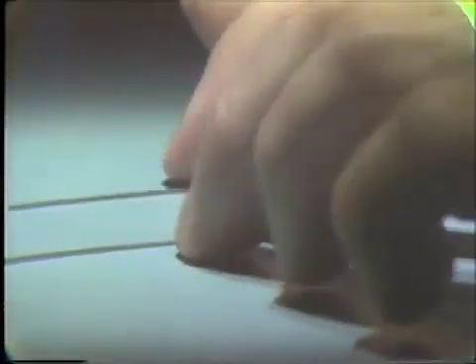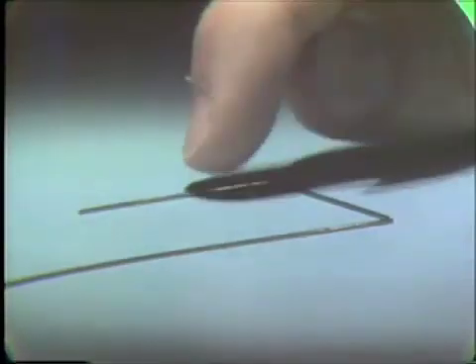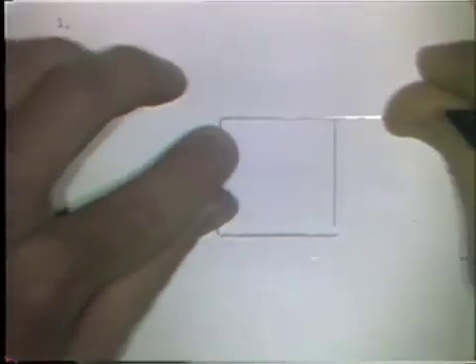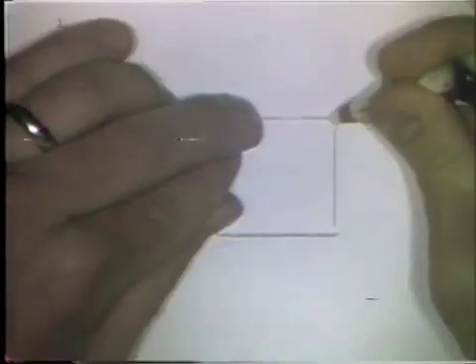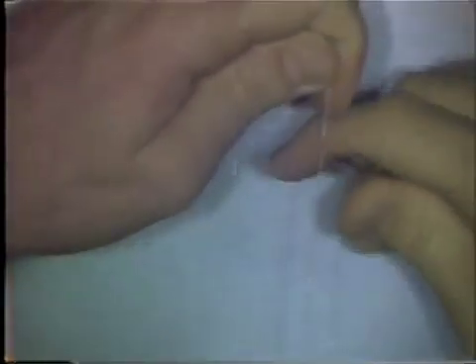You compare the wire then with a flat surface like a glass slab or a formica surface. And if you made the first 30-degree bend correctly, I don't think this needs adjustment. Generally, the second bend will come out pretty accurate, in the same plane of space as this first leg. You place the wire back on the pattern, and in exactly the same manner, mark the wire at the corner where you want the third bend to be made, and complete the bending of this third right angle bend.